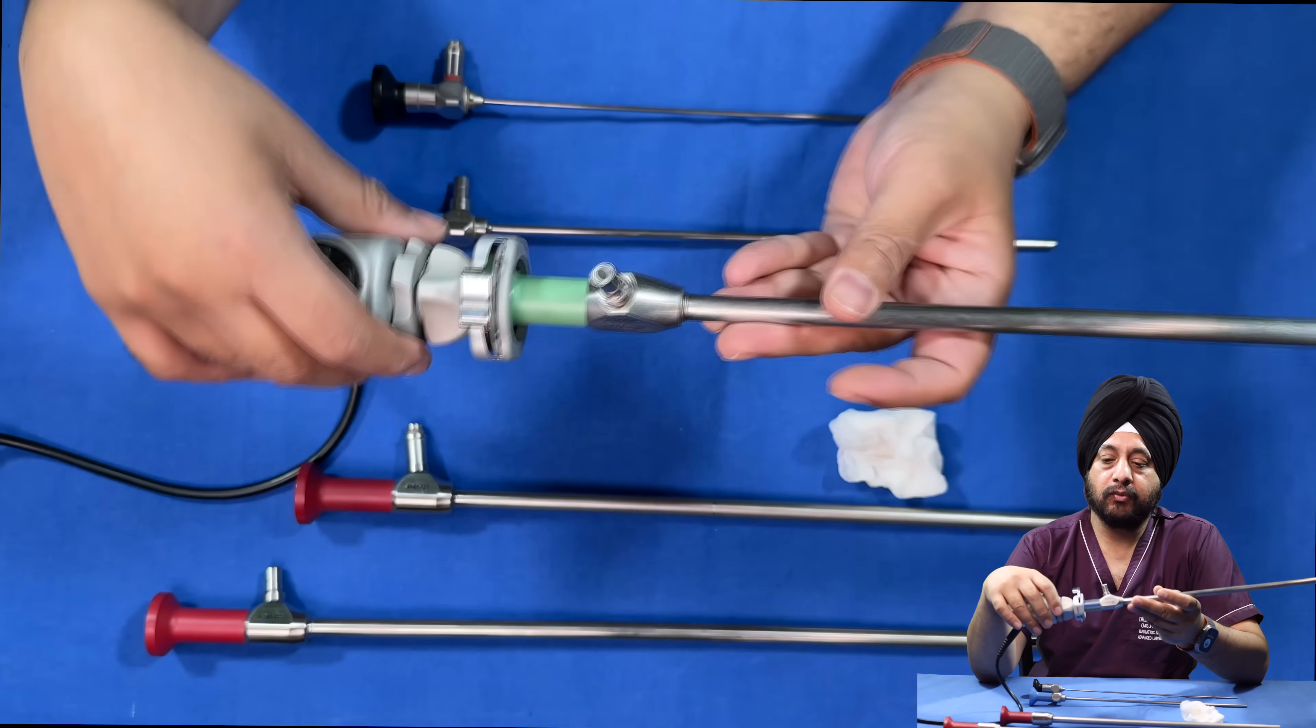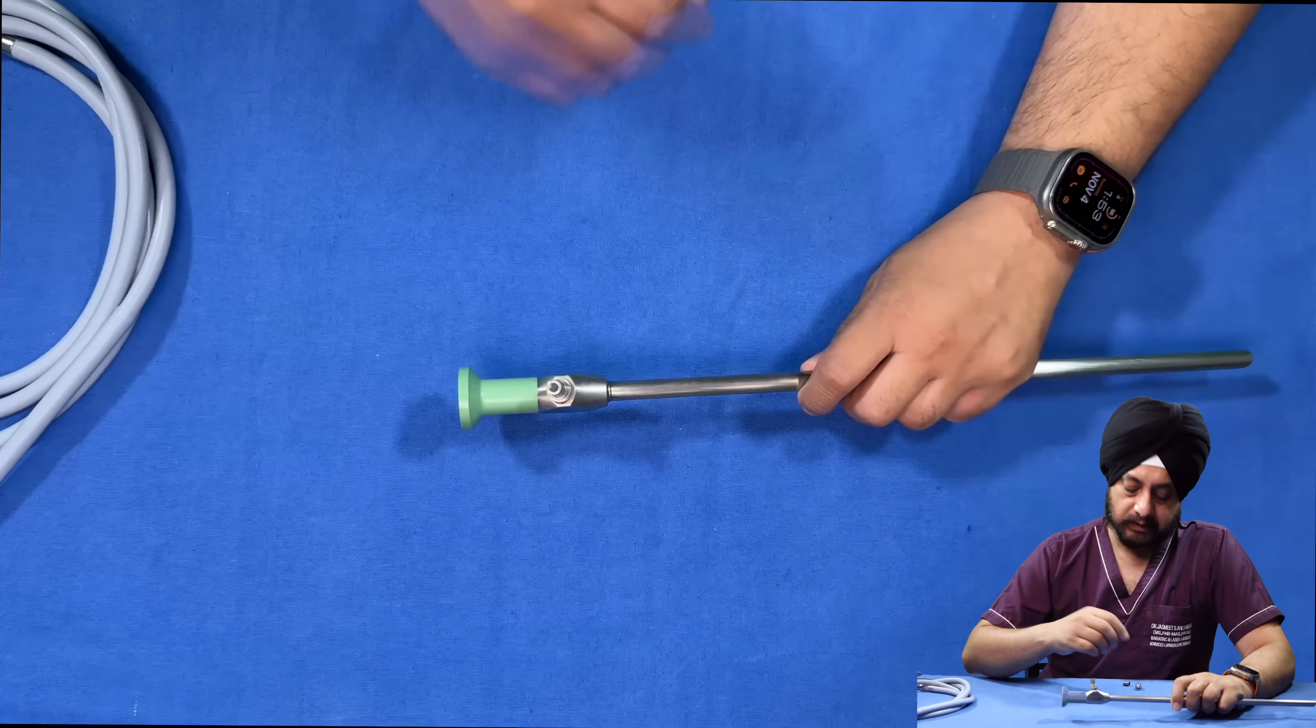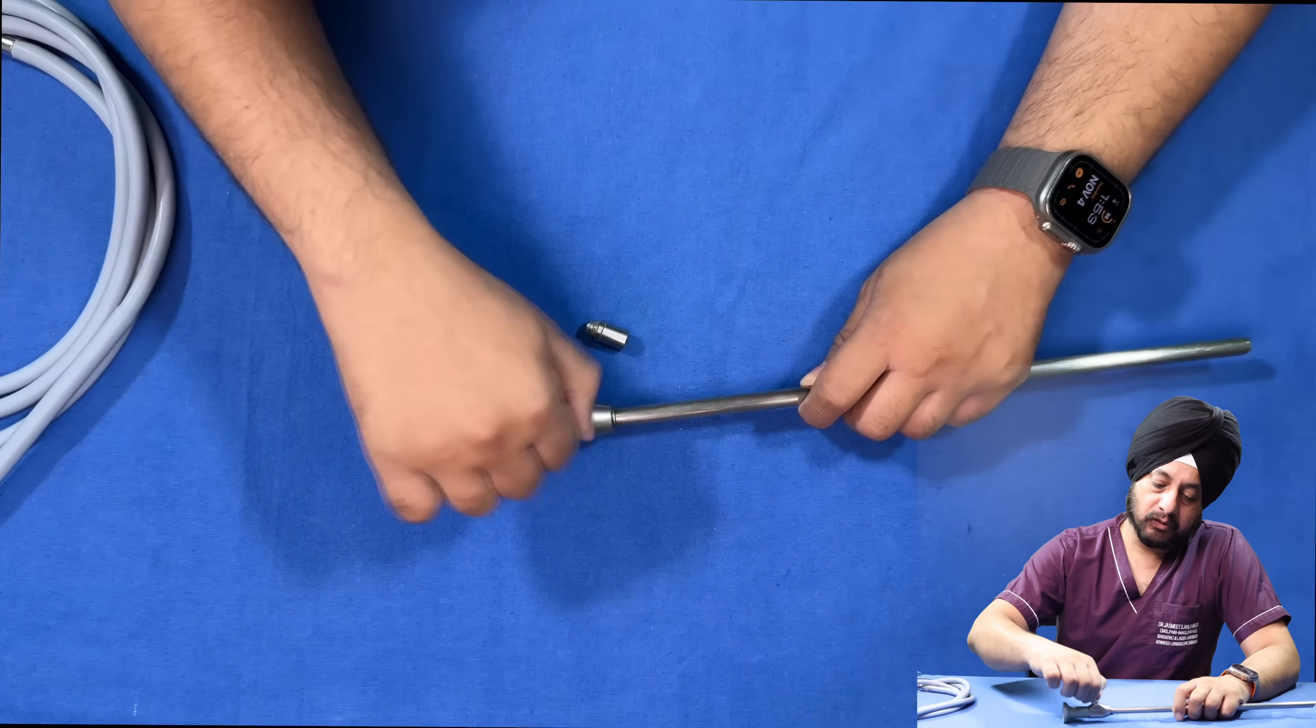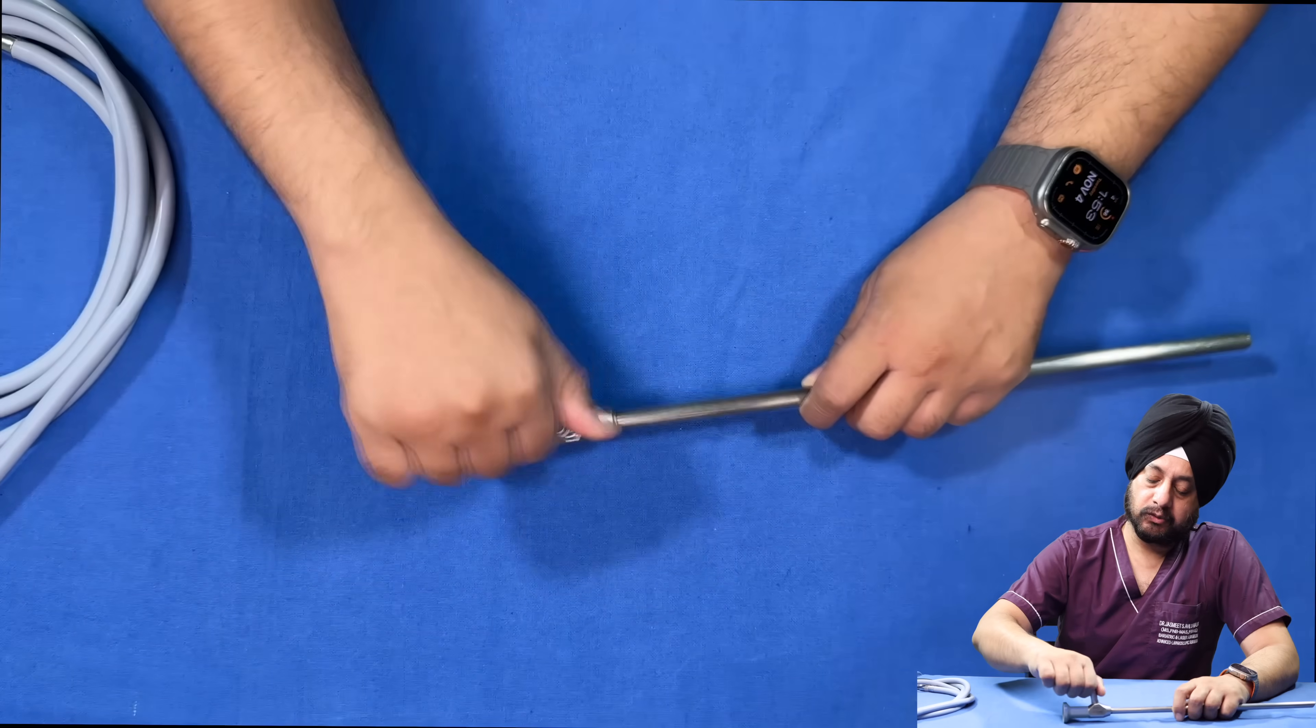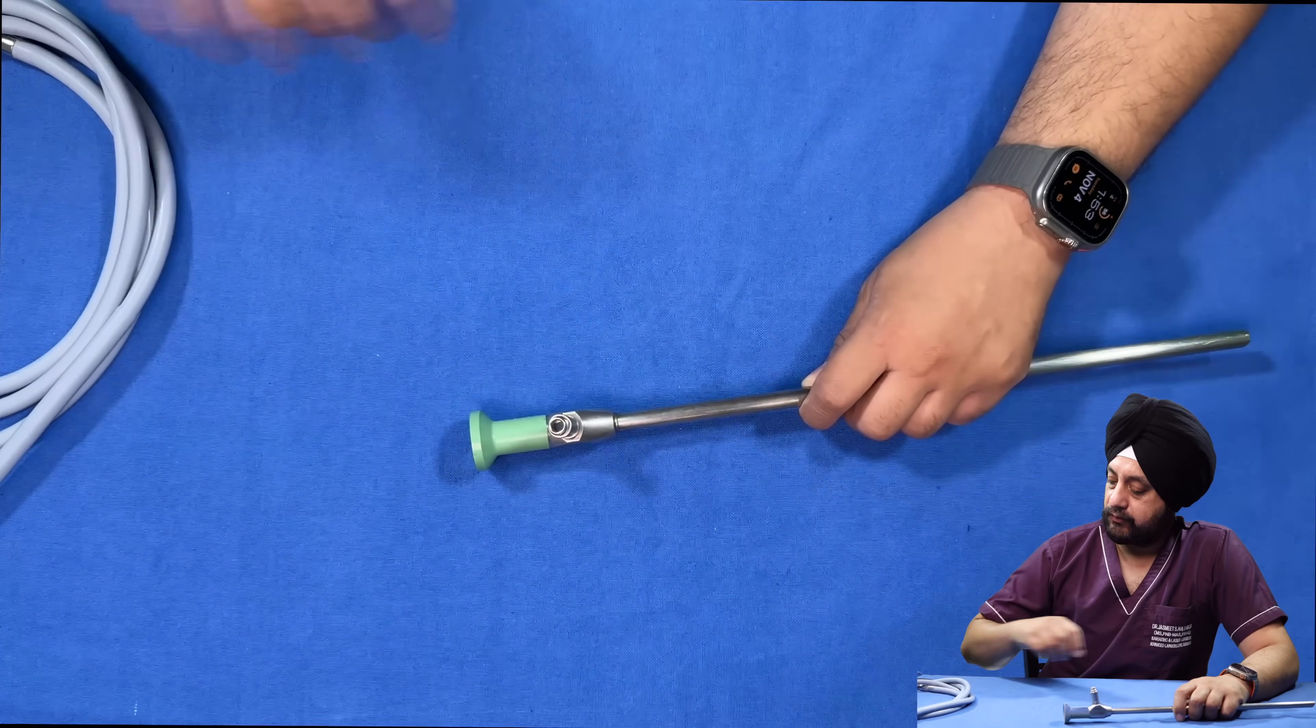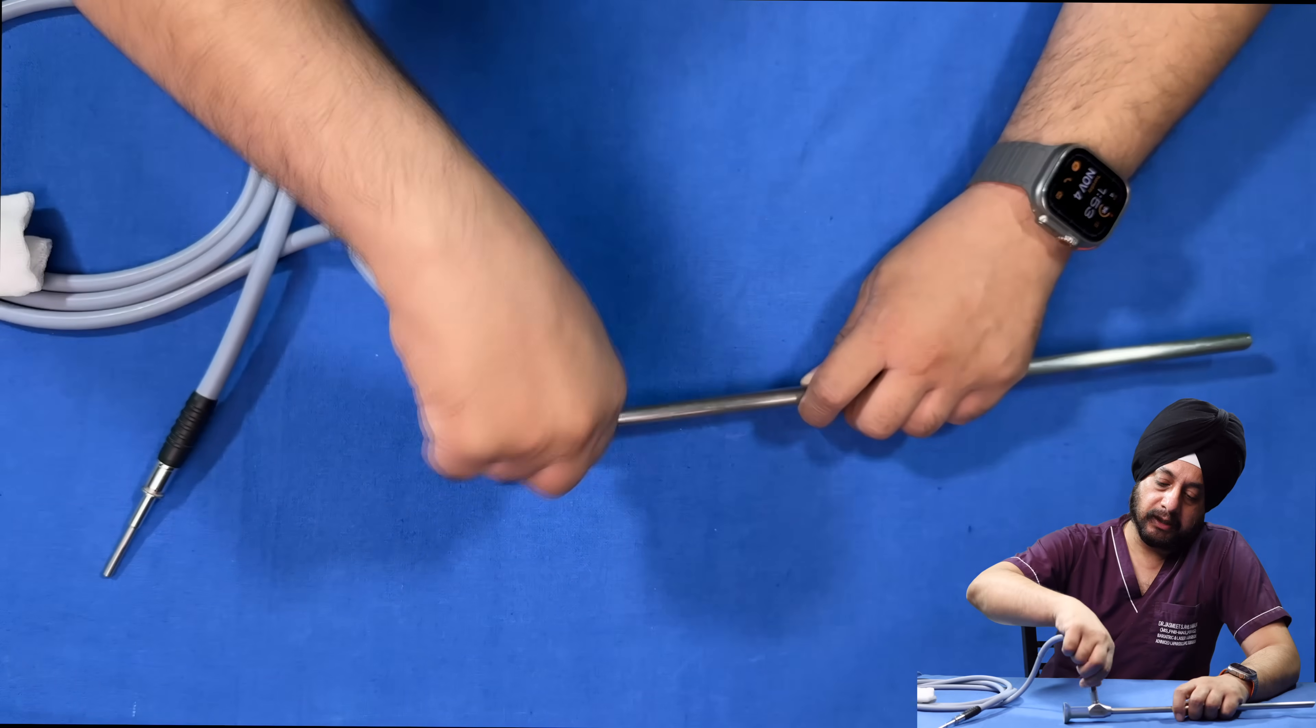This is the connector for connecting the light cable. Most scopes will have at least two adapters. This one attaches over here, and the next one gets screwed over that. This is to connect different kinds of light cables.